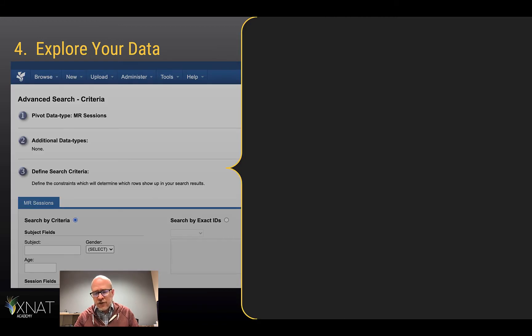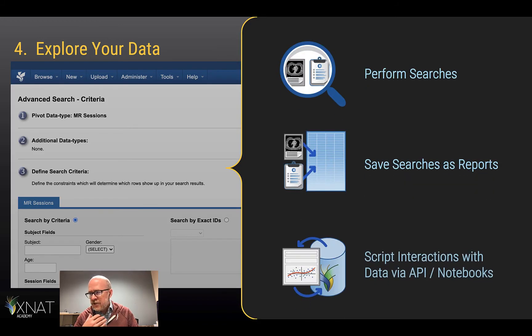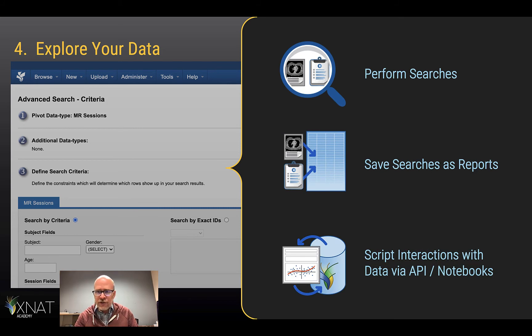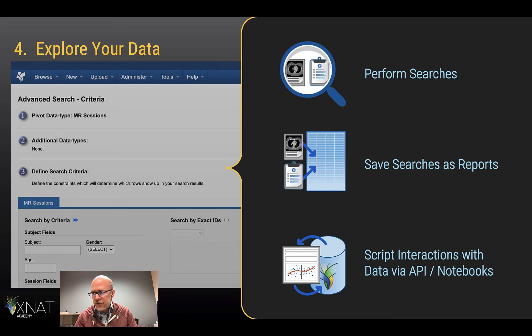You can also explore your data — imaging and clinical. You can perform searches and save those searches as reports, which you can then share with other users. You can even access data from outside your XNAT through authenticated APIs.